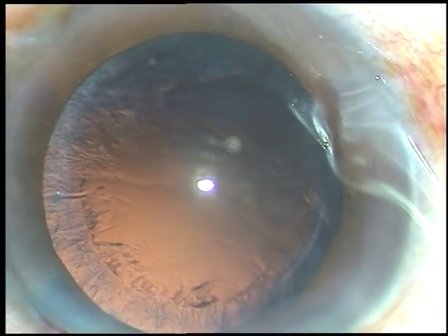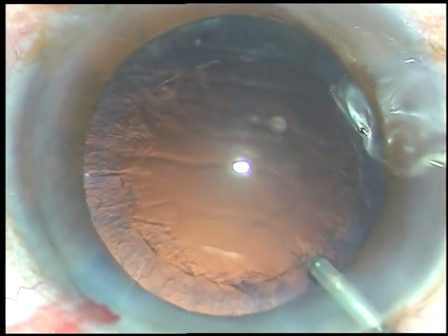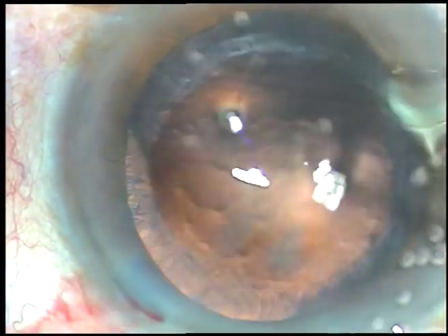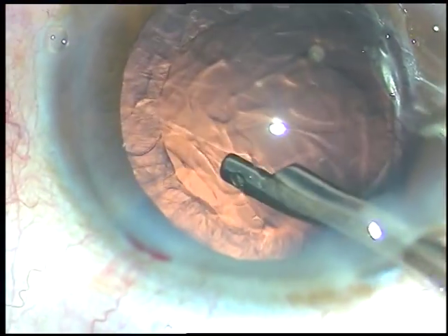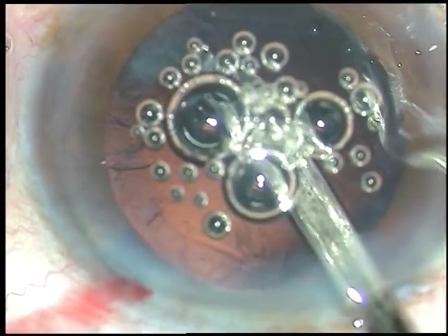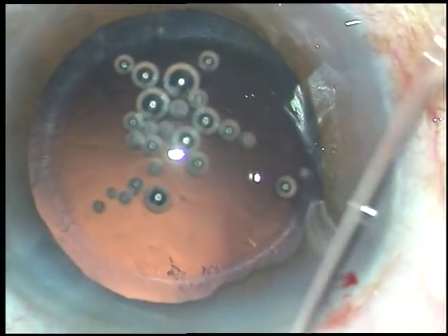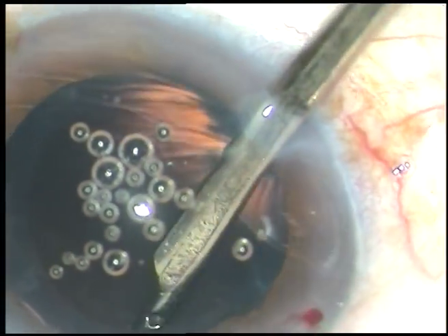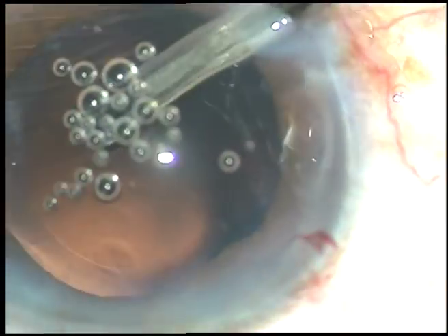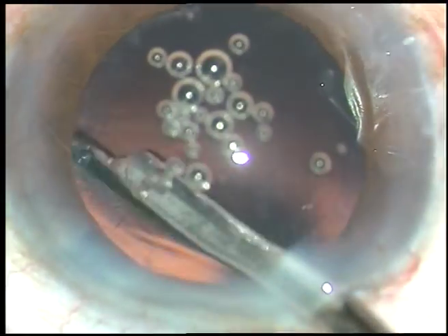The nucleus management part in this video is not at all edited — you have watched each and every step of the nucleus management. Now the rest of the surgery is going to be edited. Cortical cleanup is being done with a 23-gauge Simcoe cannula. You can use bimanual IA or coaxial IA. The goal is to nicely clean the cortical matter, and we can do some polishing of the posterior capsule — but be careful not to cause posterior capsular rent while polishing.